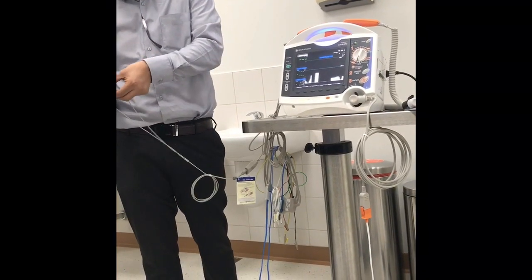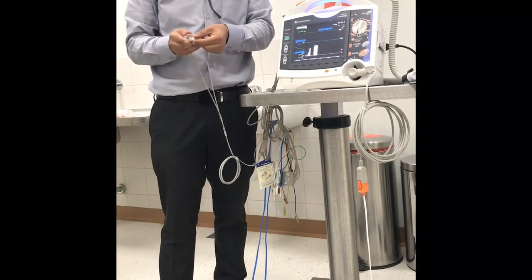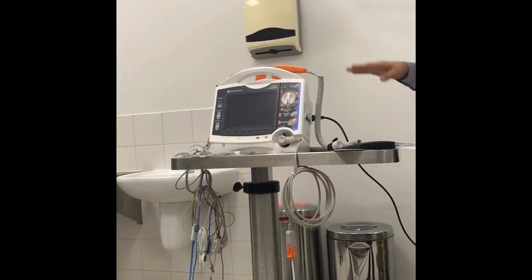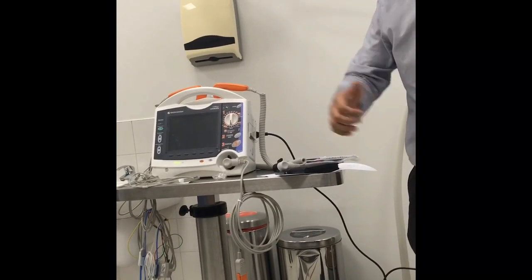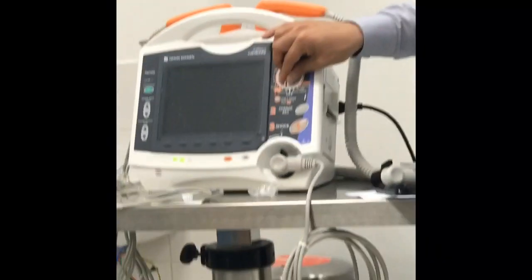To start operating the system, as I mentioned before, this is a monitor. It can be used as an AED. It can be used as a manual defibrillator. For the monitor function, I can switch this one to the monitor, and we can connect all cables to the patient: 12-lead ECG, SpO2, etc. So all parameters will be here. Okay?